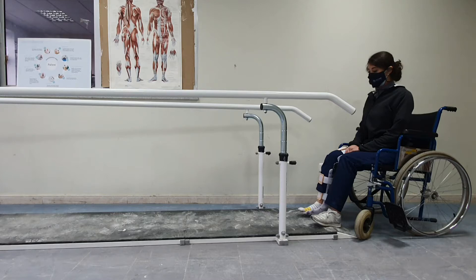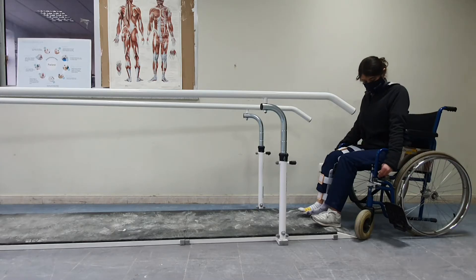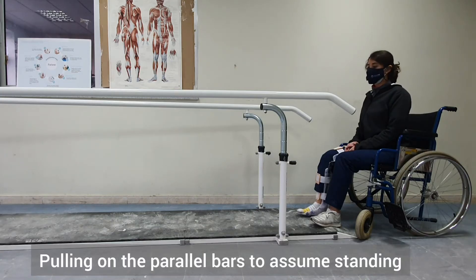First, the patient is sitting next to the parallel bars. Here we will remove the leg rests, put on the brakes, and sit at the edge of the chair.